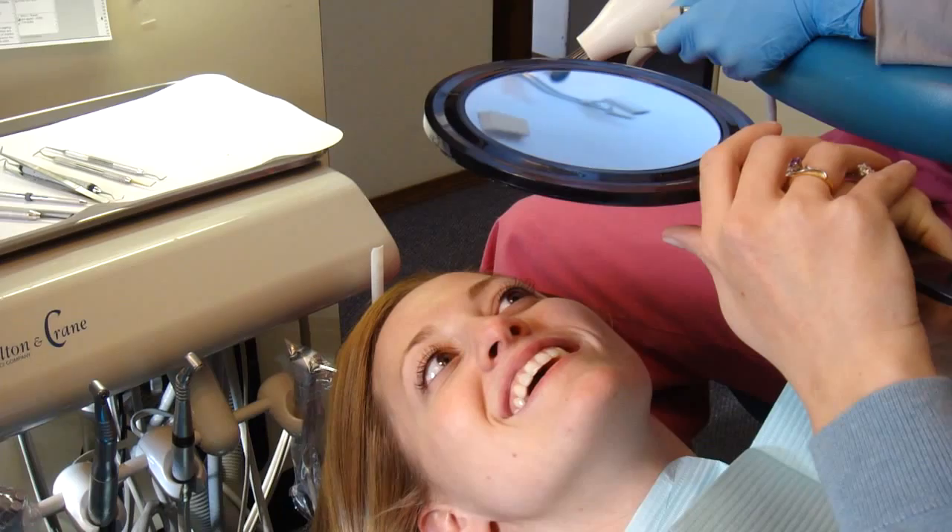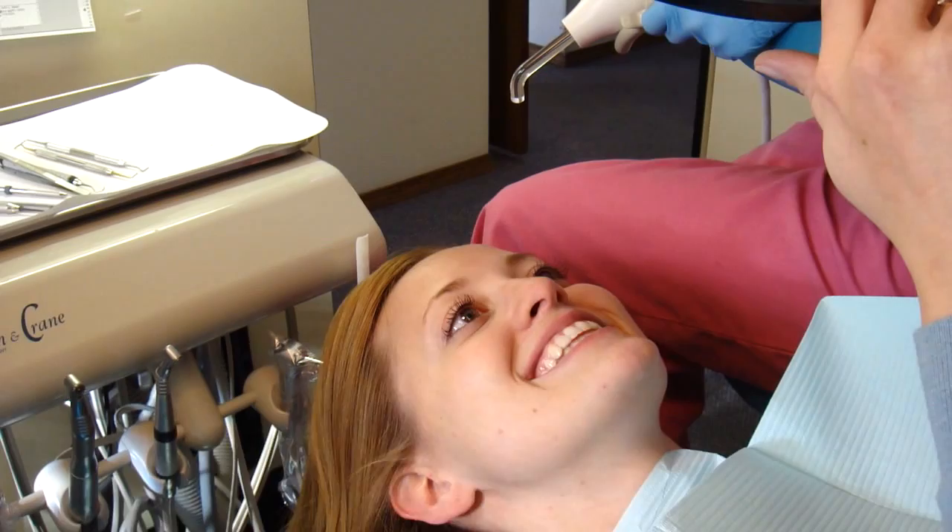It's more even. Yeah, I think those teeth all flow now. Yeah, I think they all look good together. Oh, this looks so good.